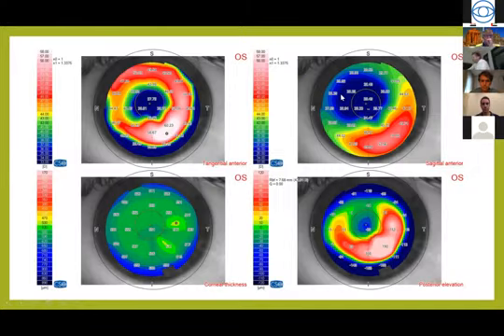And this is the topography, the usual topography of an old radial keratotomy, where if you are not familiar with this, what you see is the similar anterior tangential map like in an old myopic LASIK, with a central flattening and a quite significant spherical aberration here, but with the difference that the corneal thickness is normal, is not affected, because here you are not ablating any tissue. Here there is some decentration, okay, it's an old RK, with the posterior.